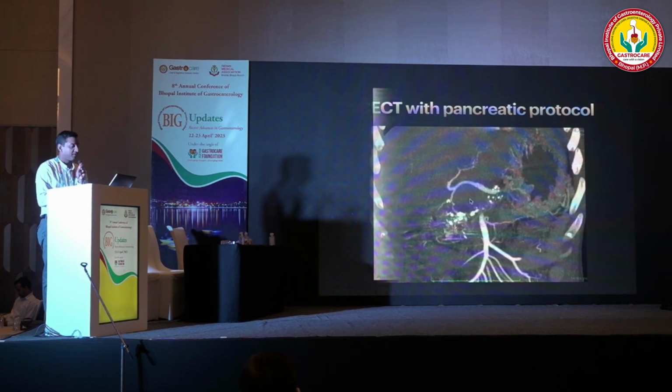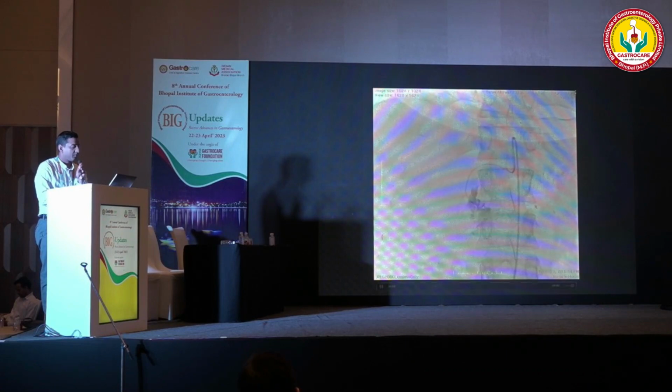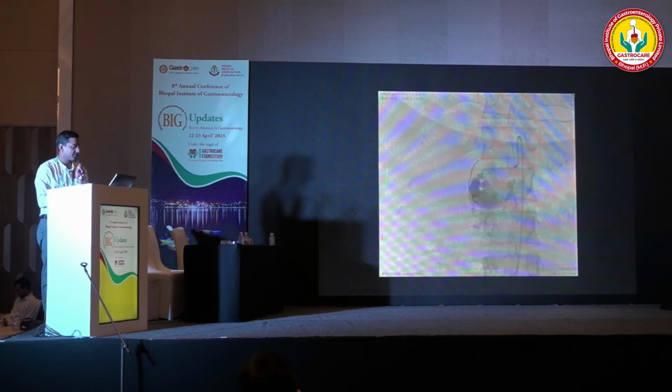We took this patient for angioembolization. This is a cine loop in which we can see the microcatheter. The microcatheter has entered the aneurysm, and by accident we entered this cyst, which was bleeding from the minor papilla. Subsequently we embolized this aneurysm with the help of coils and PVA particles. This is how we place the coil through the microcatheter. This is the aneurysm. We have put coils distal to the aneurysm and proximal to the aneurysm, so that the aneurysm doesn't fill from both sides.